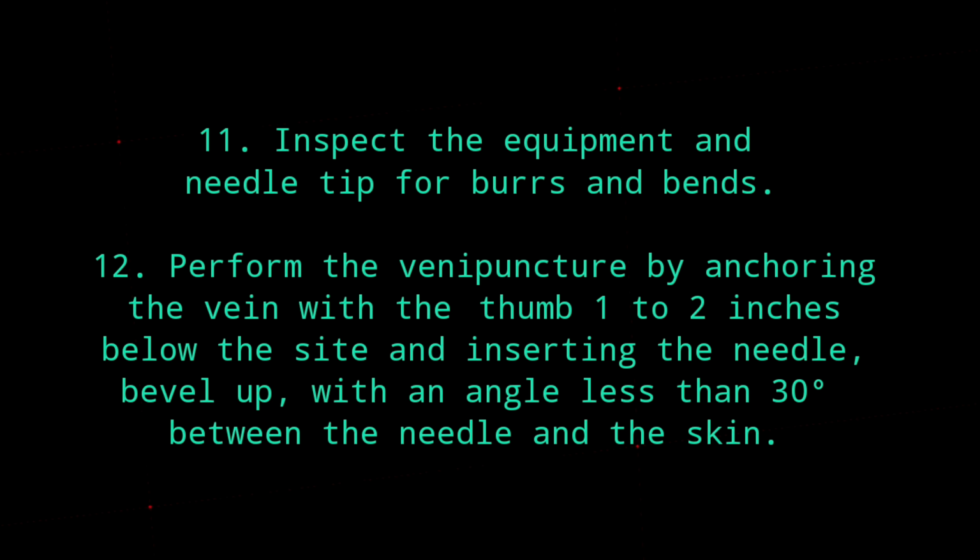Inspect the equipment and needle tip for burrs and bends. Perform the venipuncture by anchoring the vein with the thumb 1 to 2 inches below the site and inserting the needle bevel up with an angle less than 30 degrees between the needle and the skin.